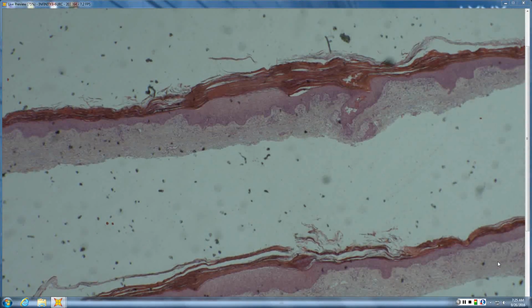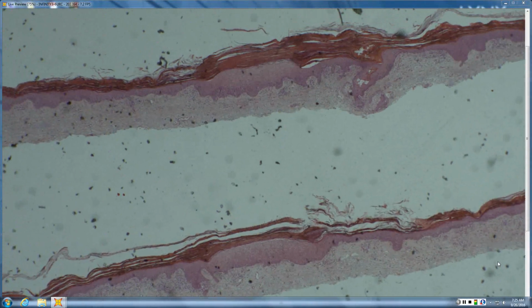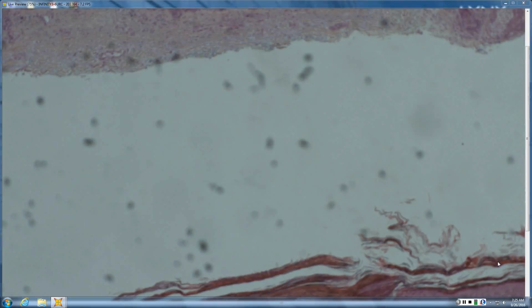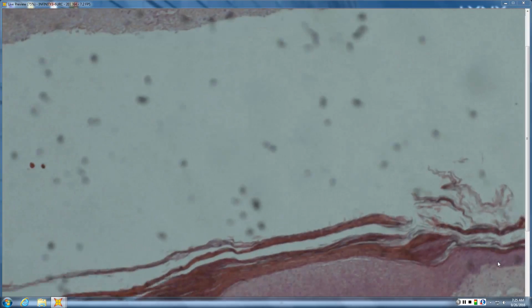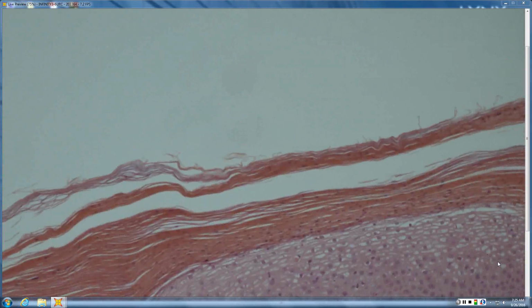So with PRP, you can get a psoriasiform acanthosis of the epidermis, but usually it's not nearly as pronounced as psoriasis. Instead of having thinning of the suprapapillary plates, you get thickening of the suprapapillary plates. So we'll come in here a little bit further, and maybe you can imagine that that's not as thinned an appearance as you saw in psoriasis. And then in the stratum corneum, you do see parakeratosis, but it's more that checkerboard pattern.